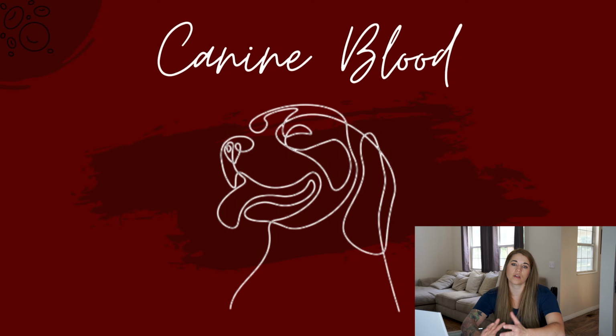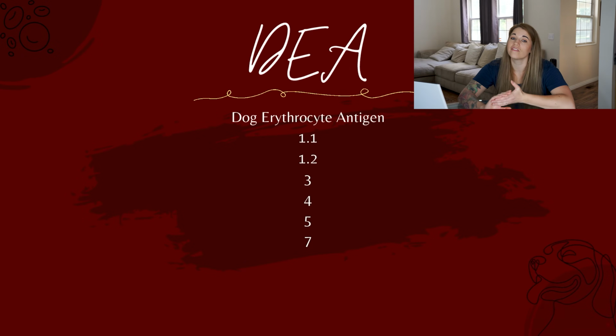In blood typing dogs, we use the DEA system, and in blood typing cats, we use the AB system. Blood typing dogs is a lot more complicated than blood typing cats, so we're going to talk about canine blood typing first. DEA stands for dog erythrocyte antigen, and it refers to the antigens that are found on canine red blood cells. There are 8 DEA antigens described, although only 6 of them are available for routine blood typing. The antigens that are available for routine blood typing are DEA 1.1, 1.2, 3, 4, 5, and 7.